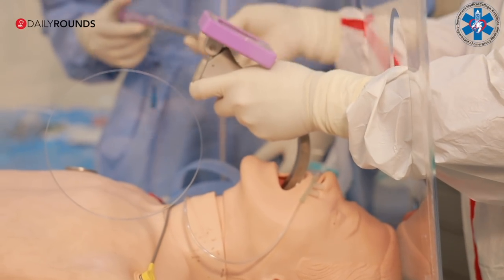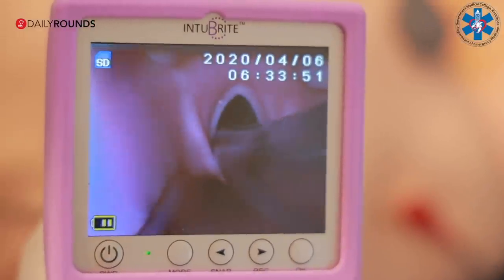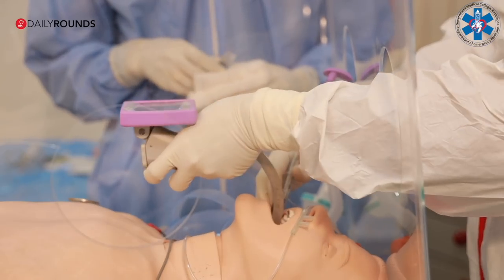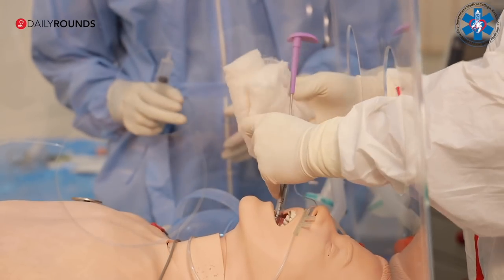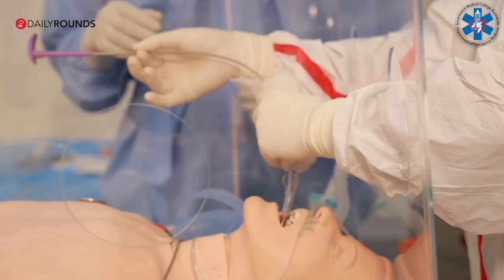Intubate with a 6.5 to 7.5 mm internal diameter ET tube in females and 7.5 to 8.5 mm internal diameter ET tube in males. Cover the adapter of the tube using a gauze pad to prevent splashing of secretions while removing the stylet or the bougie.